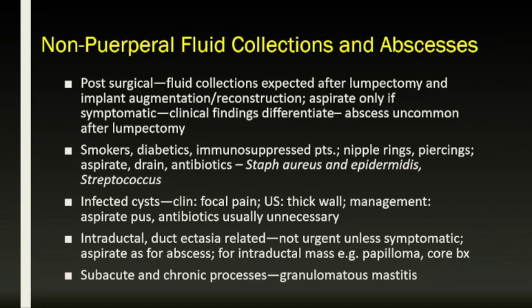If there's need for mammography during the period of lactation, the patient should empty the breast either through feeding or pumping, and then it's not a worthless exam; you can see calcifications if necessary, and a variety of other things. Post-surgical collections, high-risk patients, infected cysts, and then ductectasia-related lesions are also possible.